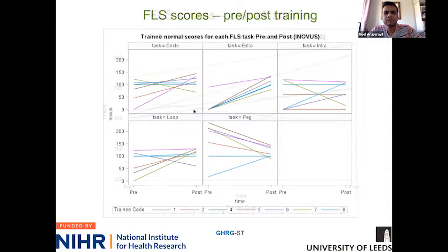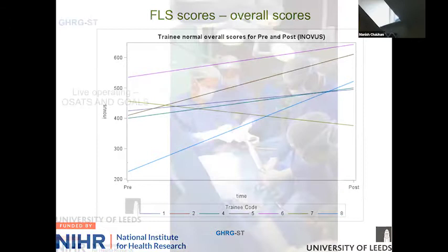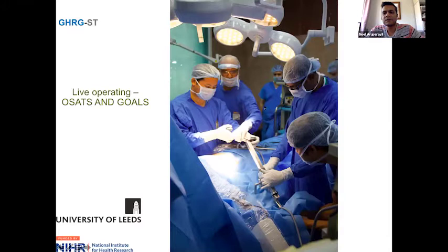These are the final scores of all our trainees who participated, and as you can see, the general trend when you sum all the scores up has shown improvement from pre-training versus post-training. But these are scores all from that three-day training program. So this is one of the pictures. Actually, Dr. Biju Isleri, who's on our call at the moment, is being assessed setting up the GILLS apparatus and then performing a diagnostic laparoscopy in a hospital in Kolkata.